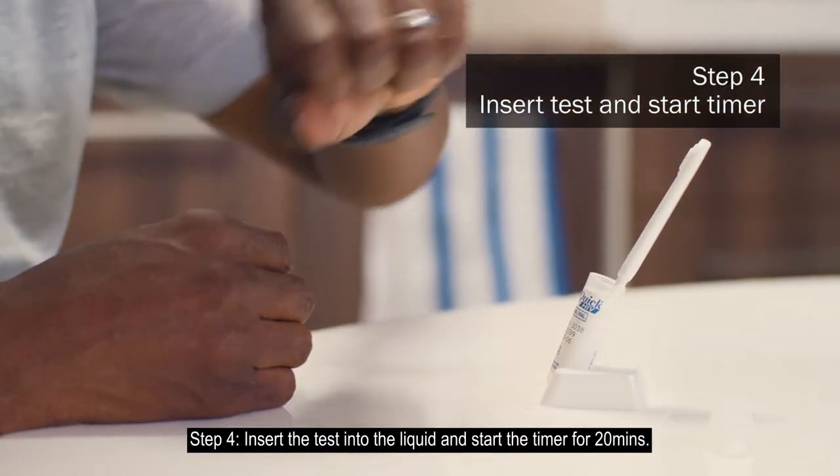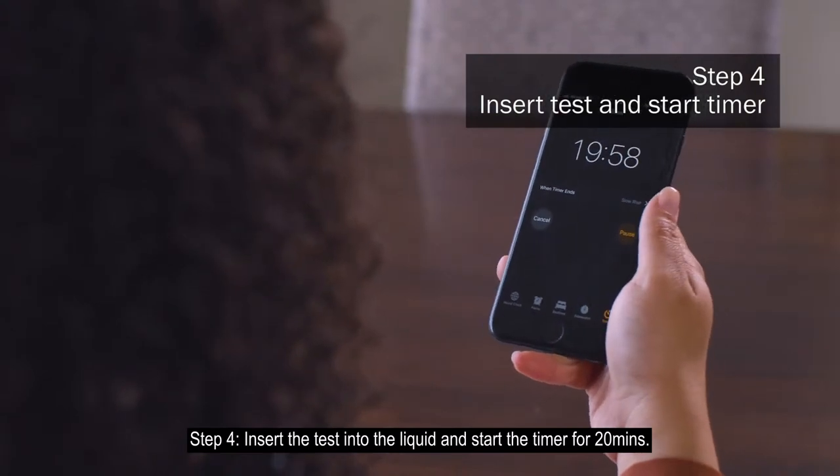Step 4: Insert the test into the liquid and start the timer for 20 minutes.